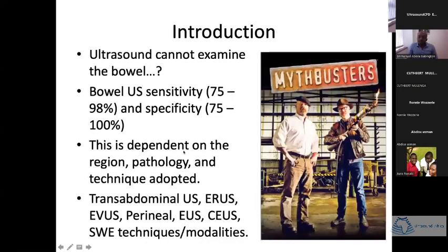Let's begin. In the past, I carried out some tests among sonographers regarding their interest in bowel ultrasound. And it was interesting to find that a number of sonographers still believe that ultrasound cannot examine the bowel due to bowel gas. And we still carry on that mindset. I hope that we are all here today because we believe ultrasound can actually examine the bowel. And hopefully by the end of today's presentation, we would all agree that it's a myth that ultrasound cannot examine the bowel.